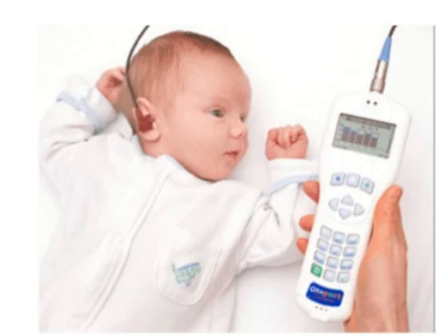Distortion product OAE, DPOAE, is evoked using two simultaneous pure tone stimuli, F1 and F2. Unlike TEOAE, which provides an overall view of cochlear function across a broad range of frequencies, DPOAE can be customized to assess frequencies that match the patient's audiogram and are more sensitive for detecting high-frequency hearing loss.